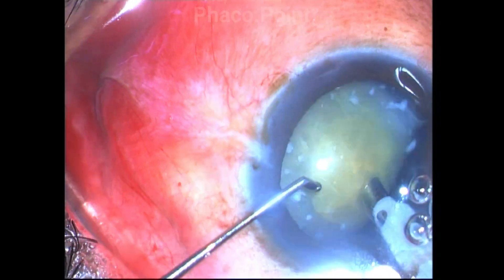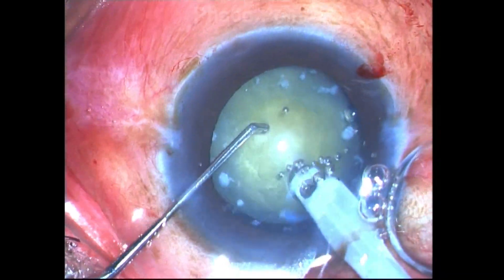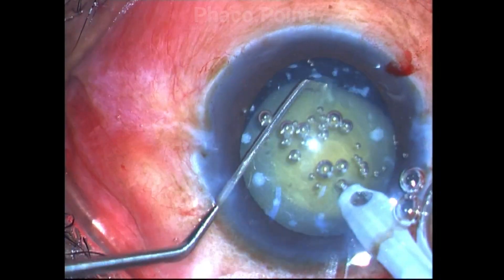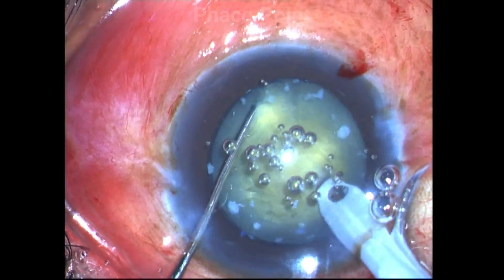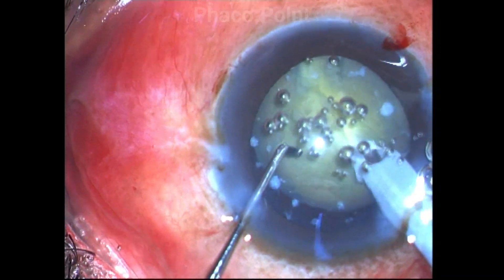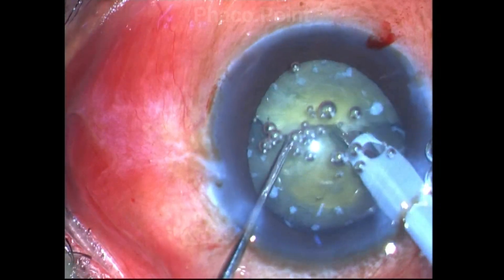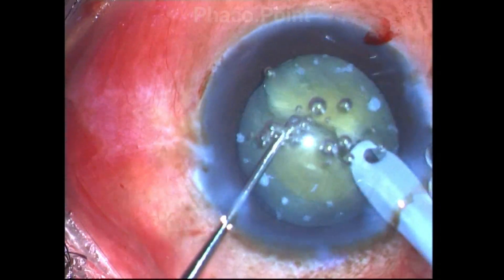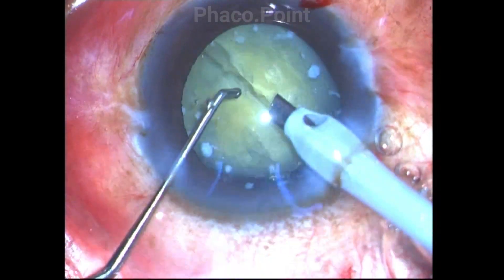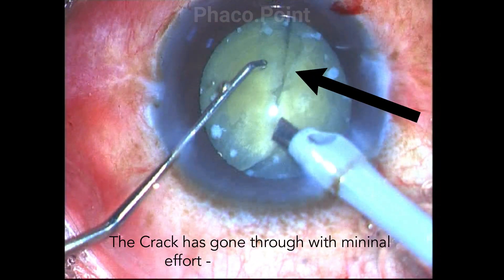After impaling the nucleus with the bevel-down position, you see the ease with which it helps to crack the nucleus. I am able to get a crack that has gone almost through and through. If you do a direct chop, it's going to be difficult because in these leathery cataracts, the lens lamellae are tightly packed together, making direct chop very difficult as it uses a shear force.